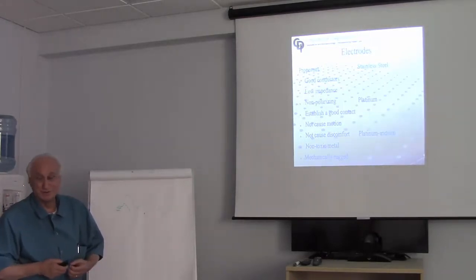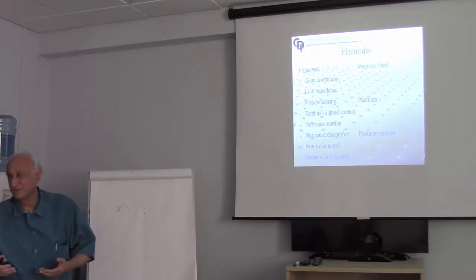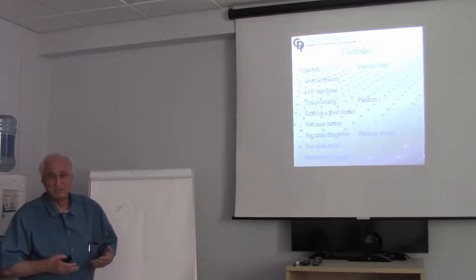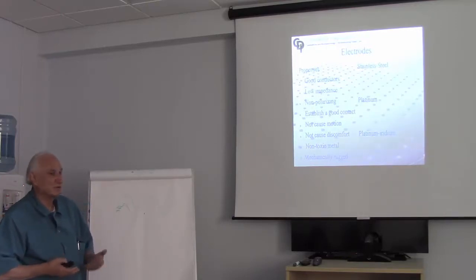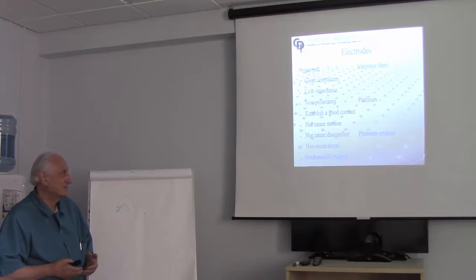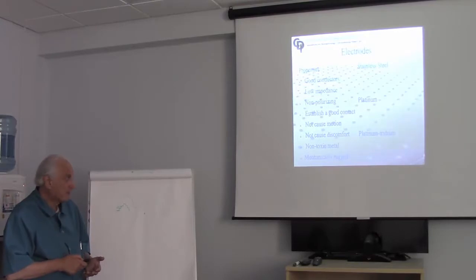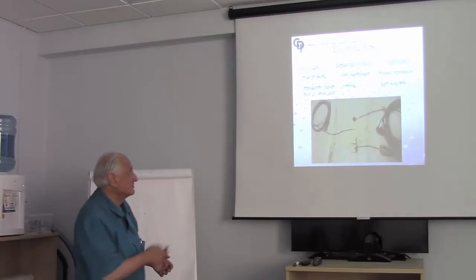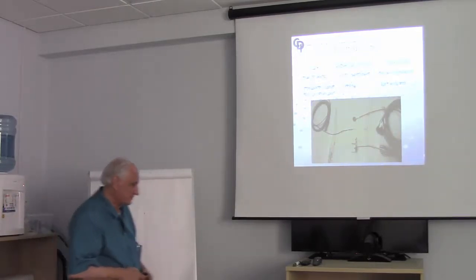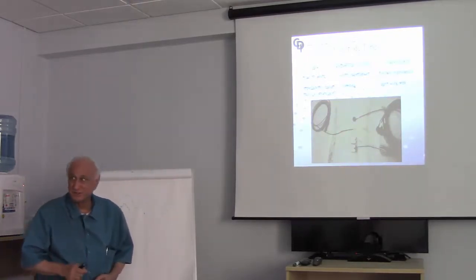So in the operating room, you put an electrode on a patient. It's a different kind of environment. The electrode's going to be there for maybe 6 hours. It can be there for 30 hours, depending on the case. So you've got to pick electrodes which work well, and you want them to be non-toxic, and you want them to be mechanically rugged. We favor these electrodes in the middle, subdermal needles, which is this electrode here, short needles, goes under the skin.